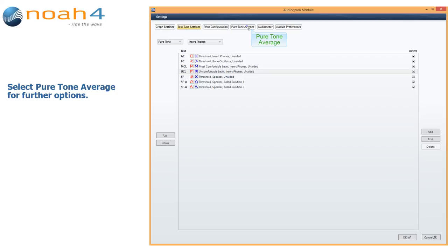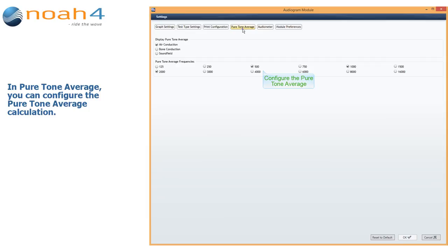Select Pure Tone Average for further options. In Pure Tone Average, you can configure the Pure Tone Average calculation.